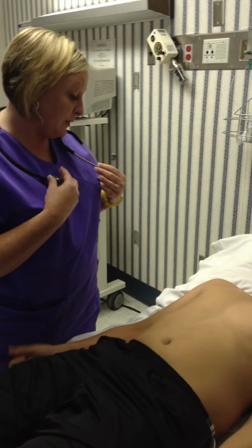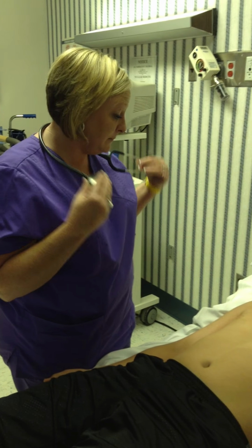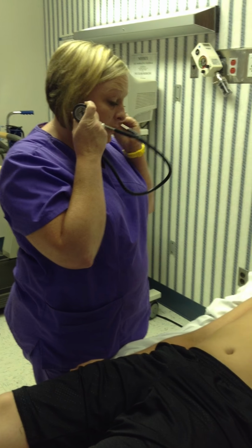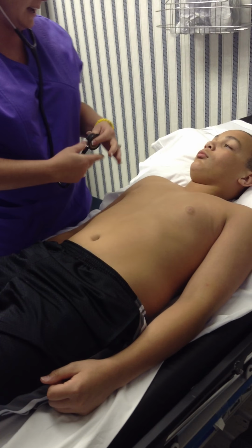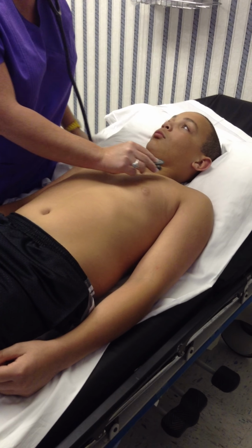Micah, next I'm going to go ahead and listen to you, okay? This time I'm going to use the bell of my stethoscope. So you want to make sure your diaphragm, and then you just turn your stethoscope, and I am going to start off at the aortic area, okay?